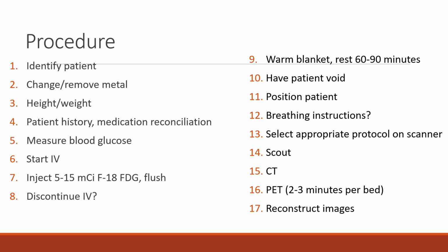And then it's typically displayed as the whole body. And then, of course, you have your slices of transaxial, coronal, and sagittal. However, if you're doing the heart, then you do the reconstruction that way. But we're just talking about oncology today.